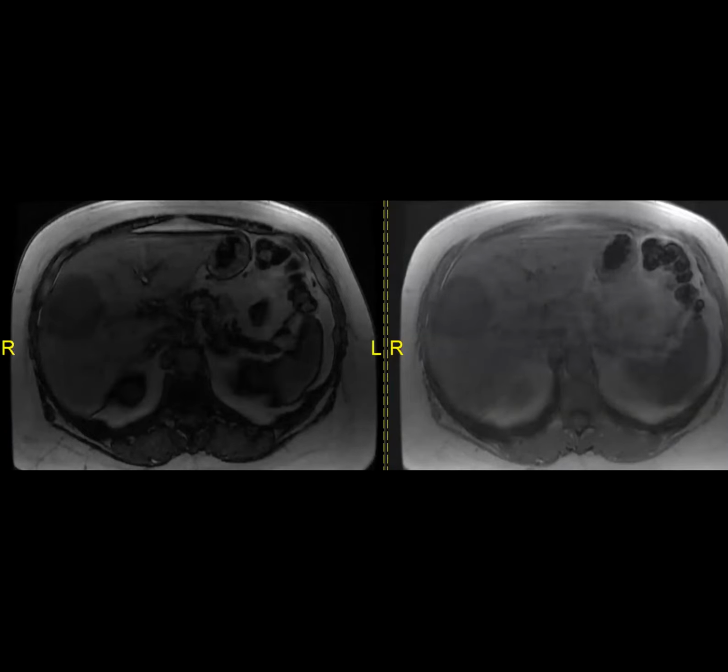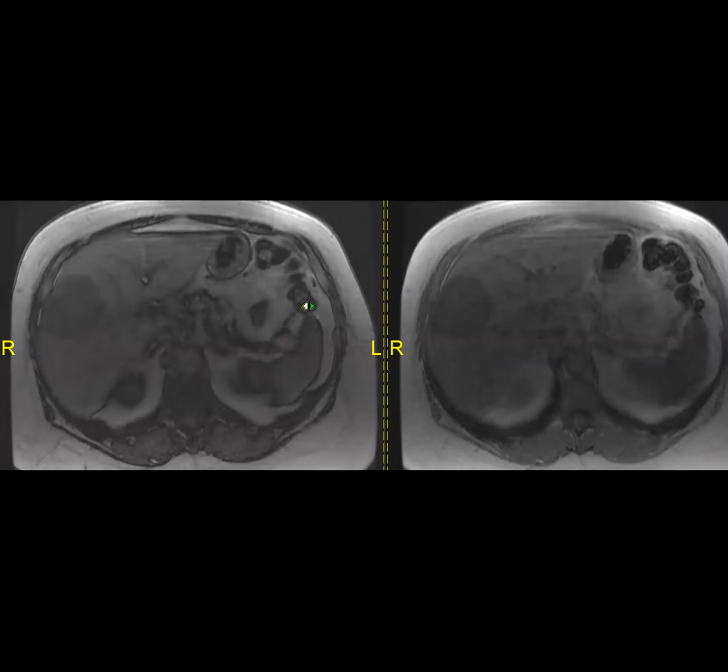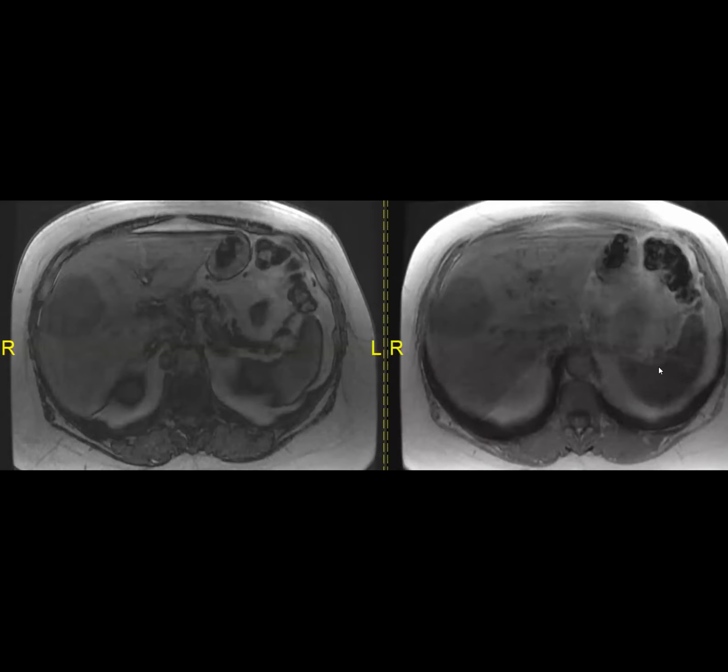Any thoughts? With a dropout, right? Nope, not really. No, you have to be very careful. But look, now it looks like so. Yeah, I would add biphenotypic subtype into this. This is a healthy patient. So it pretty much looks identical. Are you showing the T2 again?